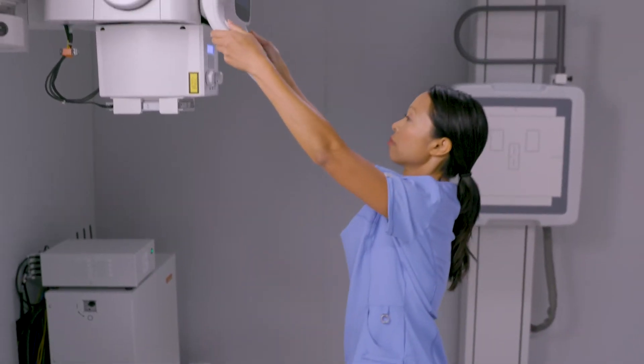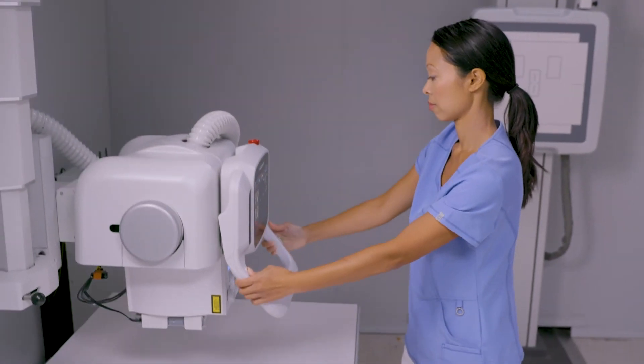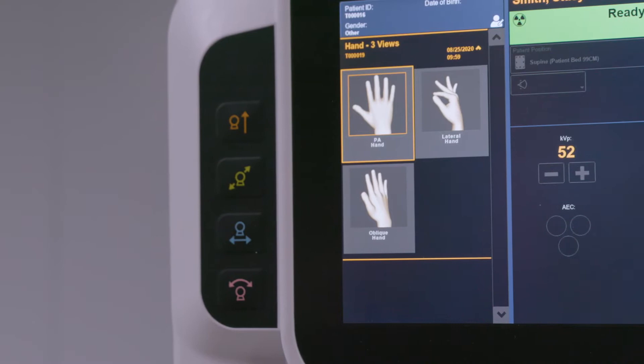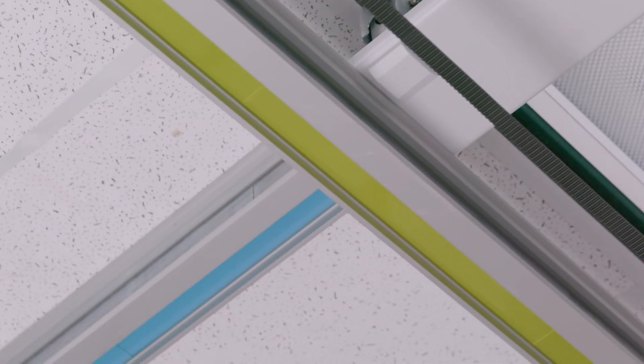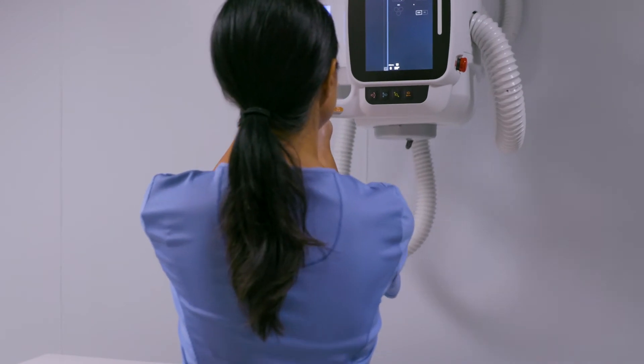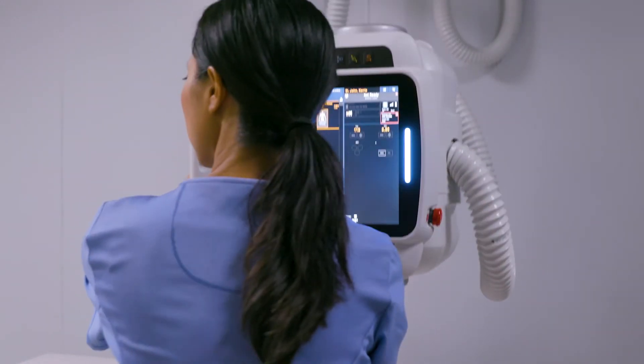The tube head has been completely redesigned. The handles are easy to reach, especially since I'm on the petite side. The color-coded buttons are a big help since they match the color-coded overhead rails. It's fast and easy for me to know which button to push based on the direction I need the tube to move.